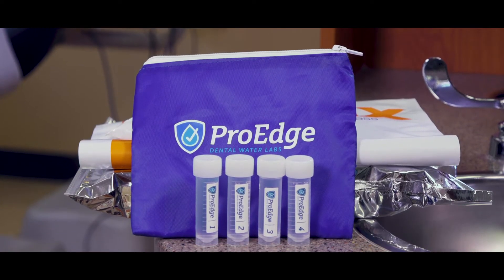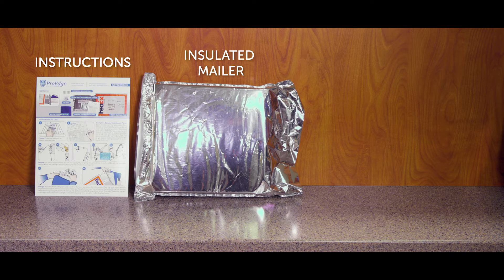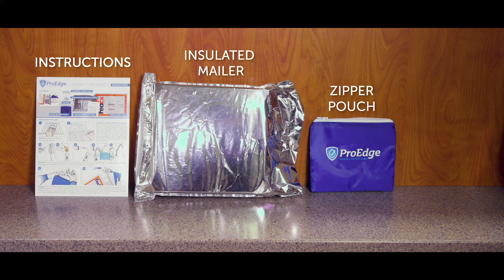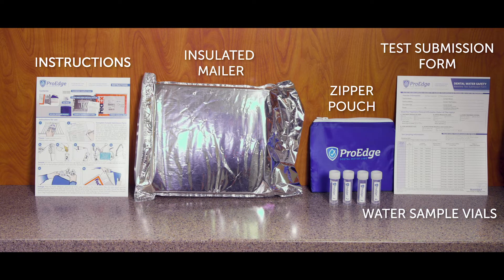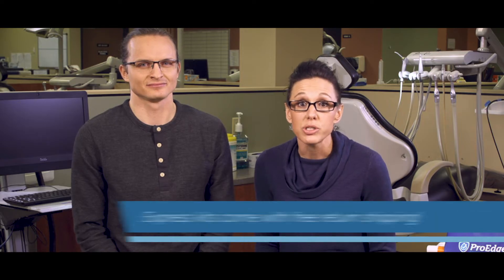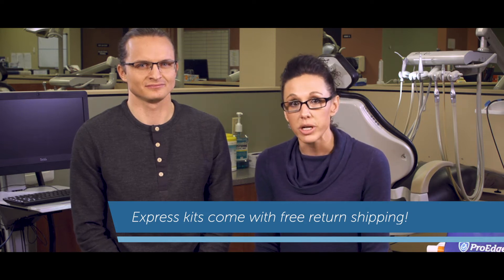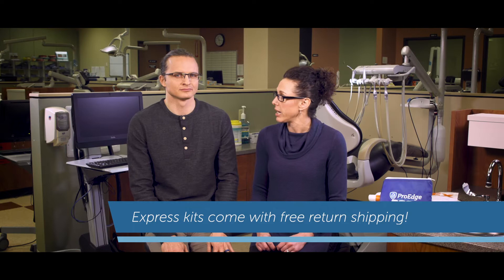Now, what comes with a ProEdge mail-in water test kit? Each test kit comes with everything that you need: instructions, an insulated mailer, a blue nylon zipper pouch, water sample vials, a test submission form, an ice pack, and a FedEx clinical pack. If you purchase an express kit, you will also have a FedEx overnight shipping label for free return shipping on your clinical pack. Each of these items will be important for testing.